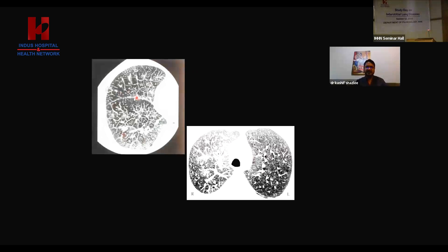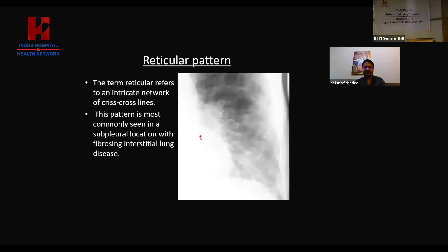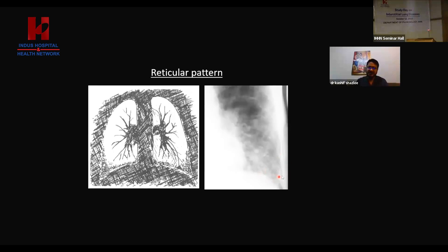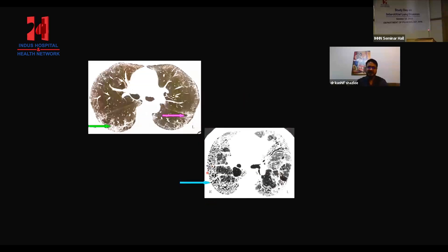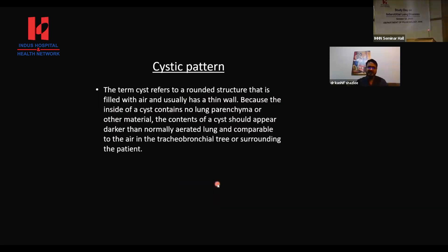Reticulation is actually the depiction of an ongoing fibrotic process. There are two types: fine reticulation and coarse reticulation. As the disease advances, the reticulation becomes more coarse. These reticulations always start from the periphery, from peripheral to central, and from lower zones to upper zones. Cystic parenchymal changes are secondary to pulmonary fibrosis, and there are multiple types of cystic changes.